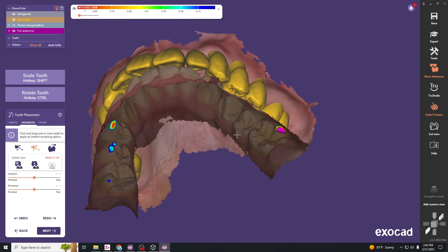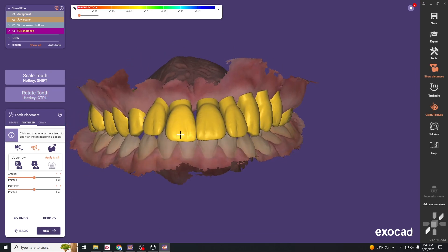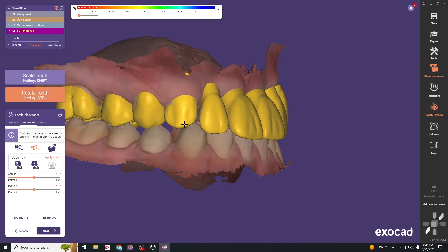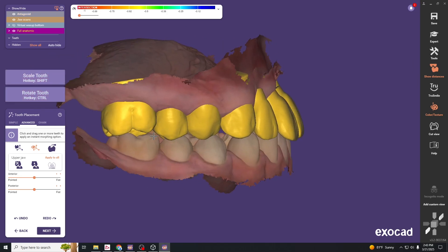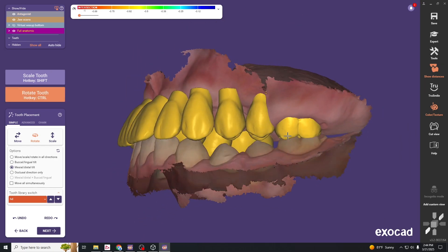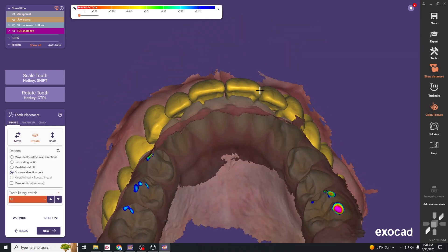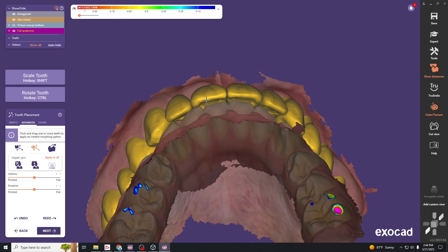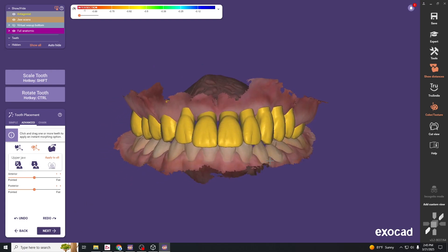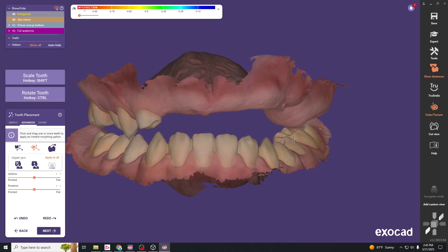Quickly go through and make more adjustments using these simple tools — clicking, rotating, and dragging. This looks like a pretty decent setup. We won't have any occlusion on the left side because those teeth aren't erupted yet.